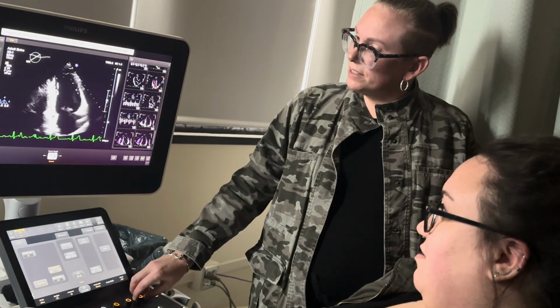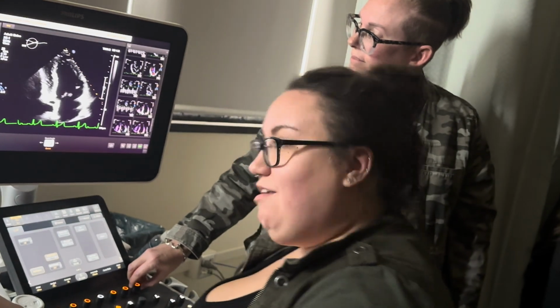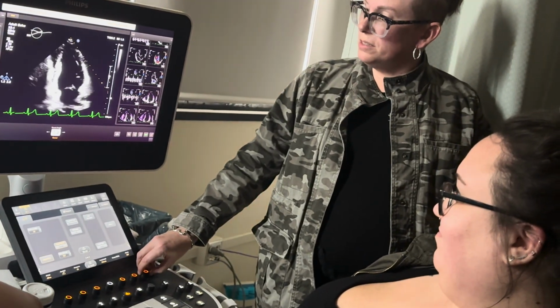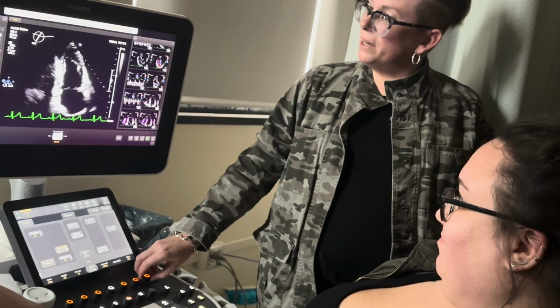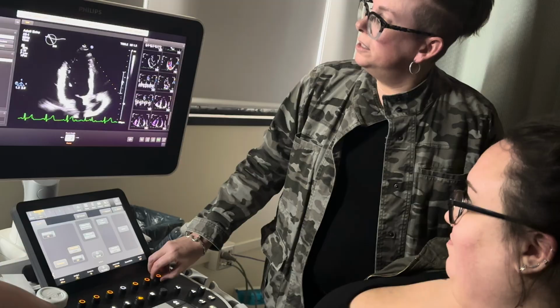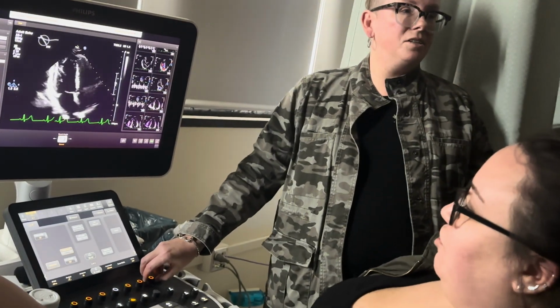It's 325, isn't it? Yeah. You're not allowed to know this yet. Look at that. I turned it to 325, and that's about where a 2 chamber is on a heart. And then I want to go back to 245, and that's about where it is for a 3 chamber. I did not move. She did not move. Wow.